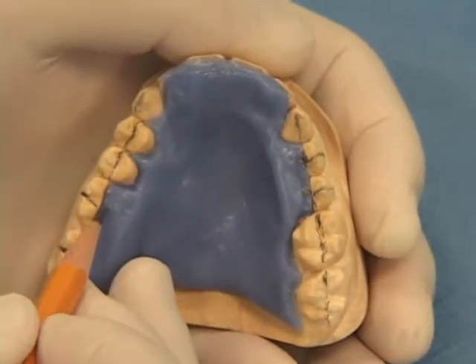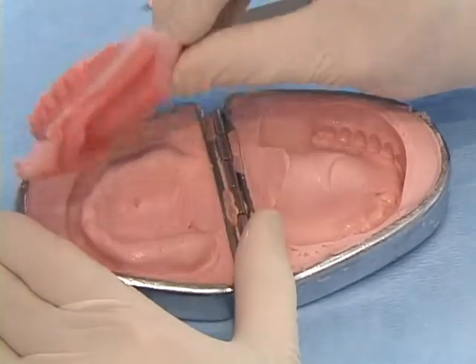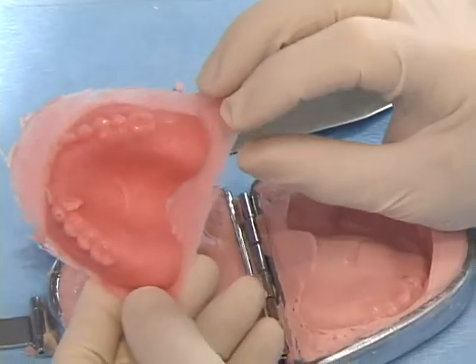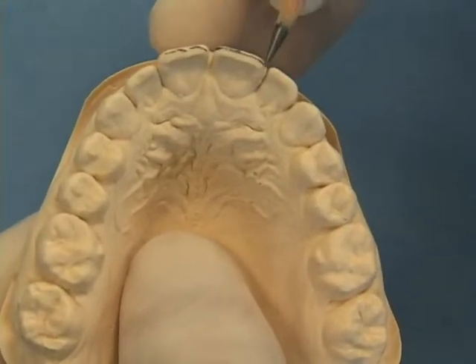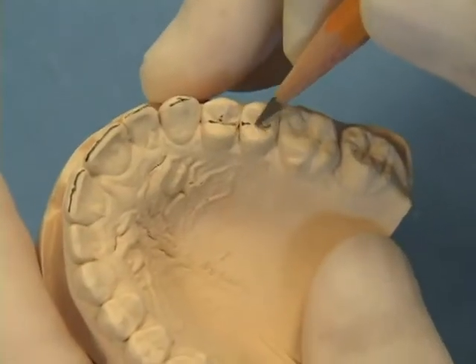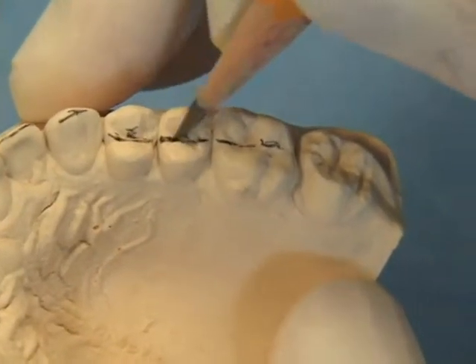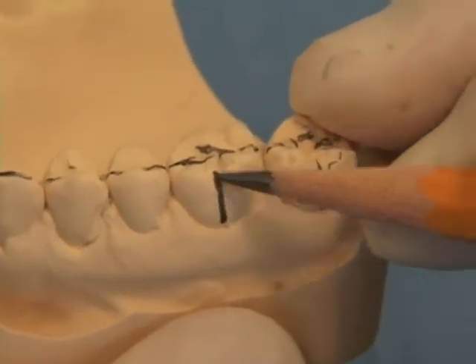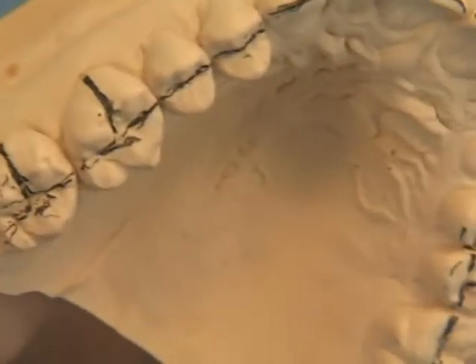Palatal templates can be fabricated on a stone model or by duplicating or using an existing removable prosthesis. When using a duplicated stone model of a diagnostic wax-up, draw a line through the incisal edge and occlusal surfaces of the teeth and another line on the facial surface through the center of each tooth to be replaced, bisecting the drawn incisal or occlusal line.